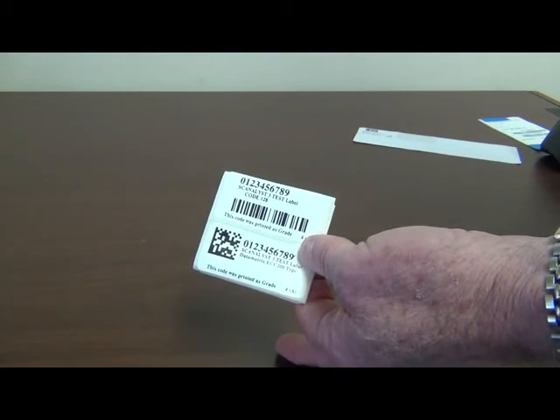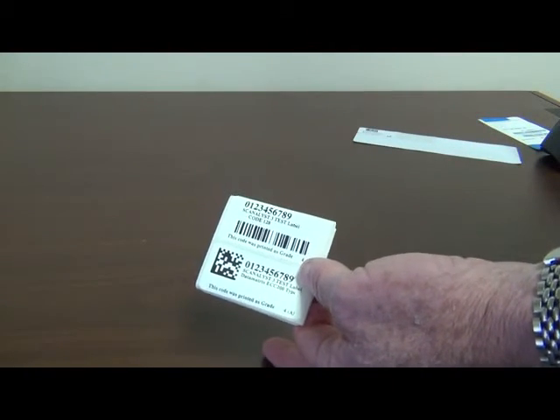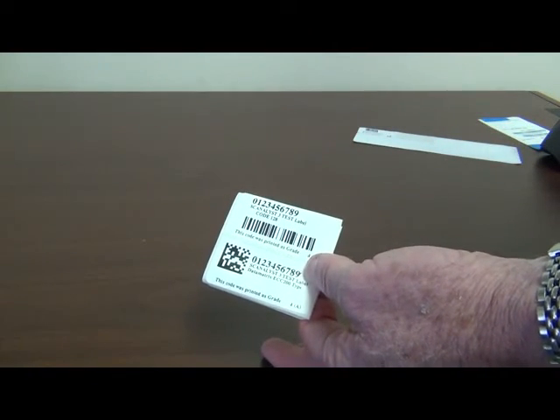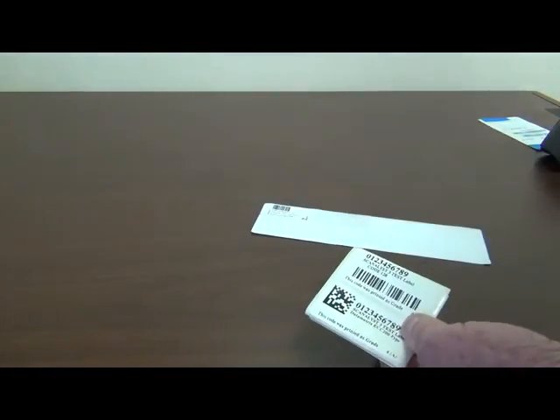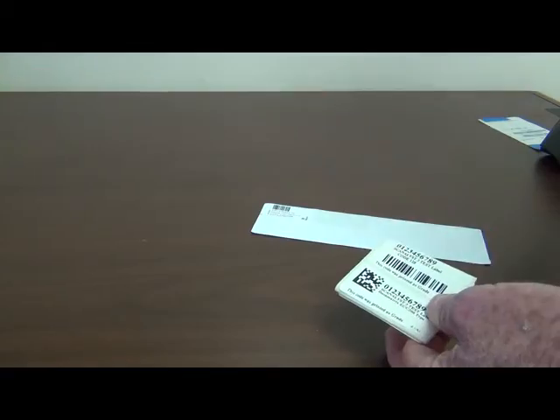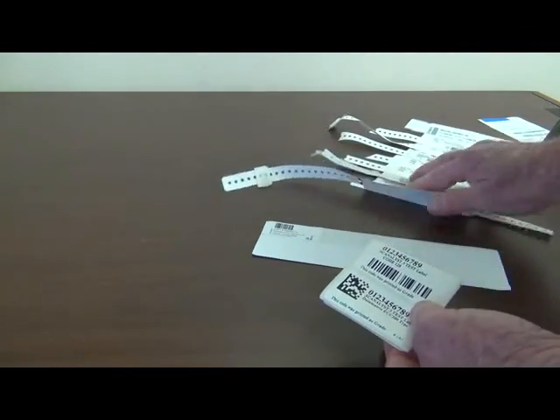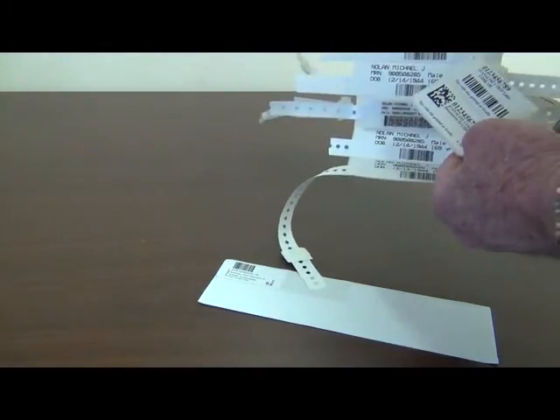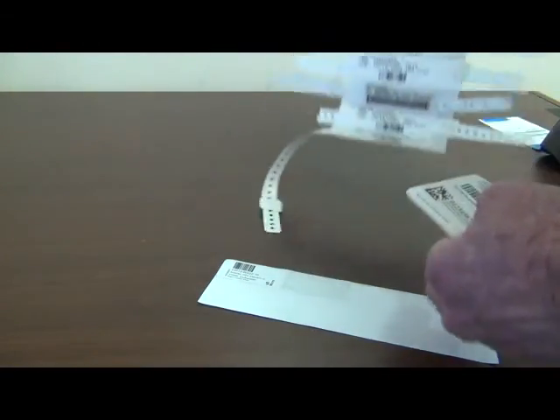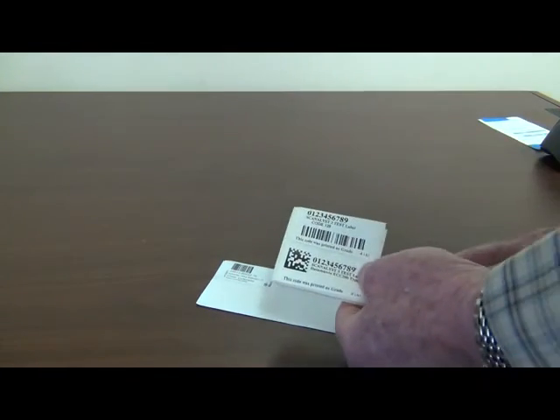And these two could be good choices for your other applications in the hospital, like lab samples, as I showed here, and maybe also things like wristbands, which we have here. There's a lot of different types of wristbands out there, and some are using Data Matrix, some are using linear barcodes, but I would suggest Data Matrix. So those are good choices.